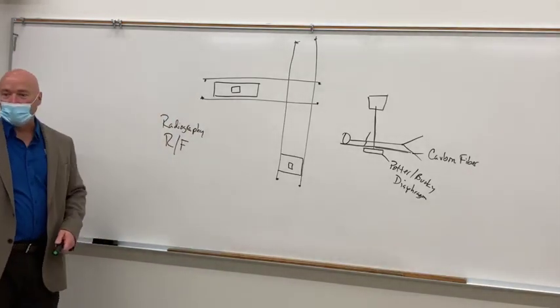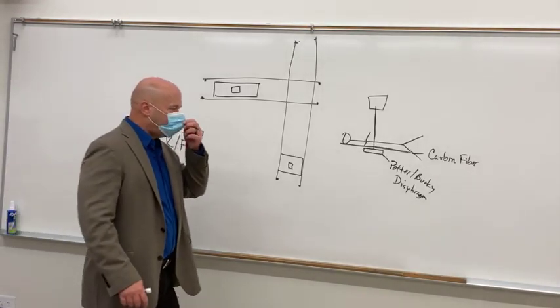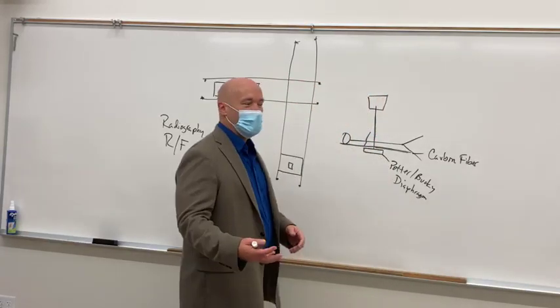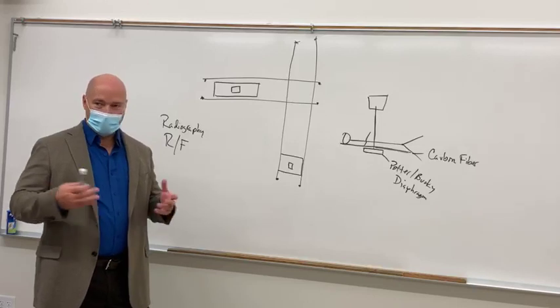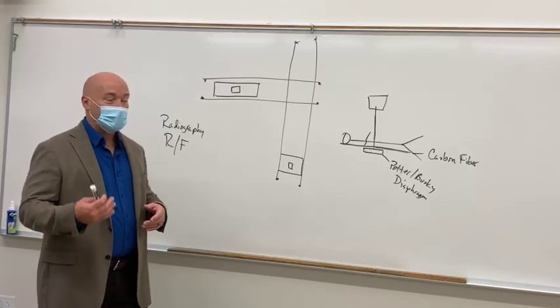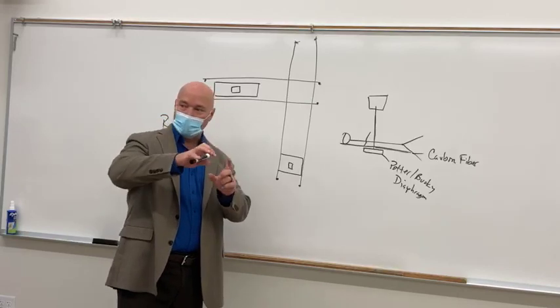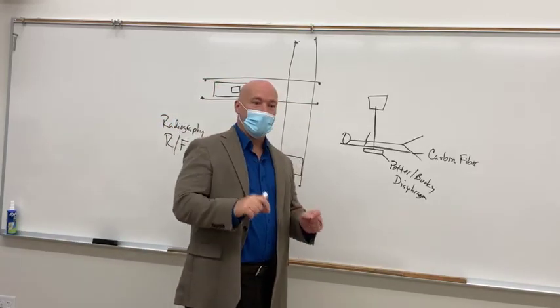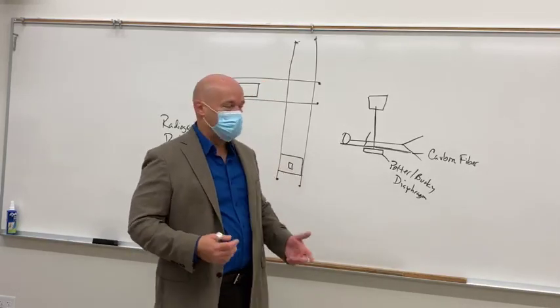It sounded a lot like that, but it's not metal. It's carbon fiber. Very rigid, but it's radiolucent. So if you ever have a patient with an external fixator, the bright metal portions are truly metal, and they're hard to see through, but the black portions, not the black portions with screws in them, but the black portions that are just the rods themselves are carbon fiber, and they absorb almost no x-rays, okay?